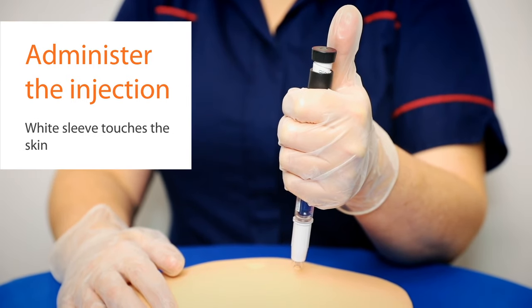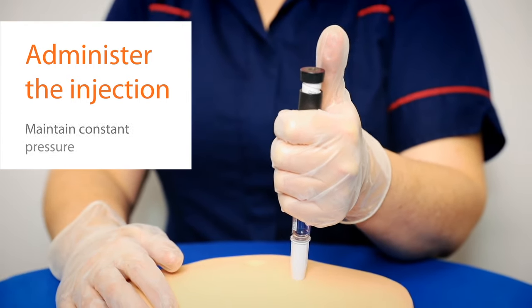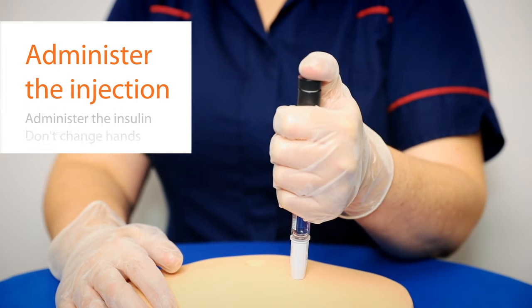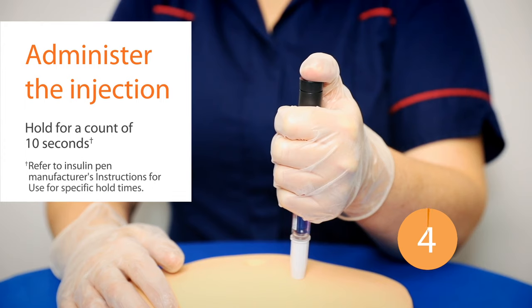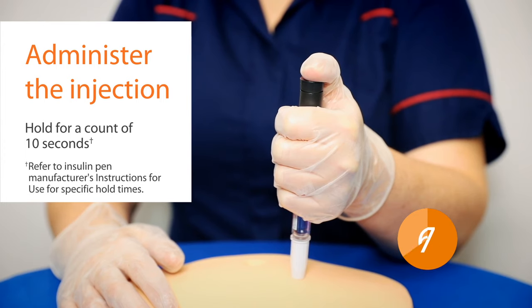Maintain constant pressure and do not change hands. Depress the insulin pen button to administer the insulin. Hold for a count of 10, or check the insulin pen manufacturer's directions for specific hold times.